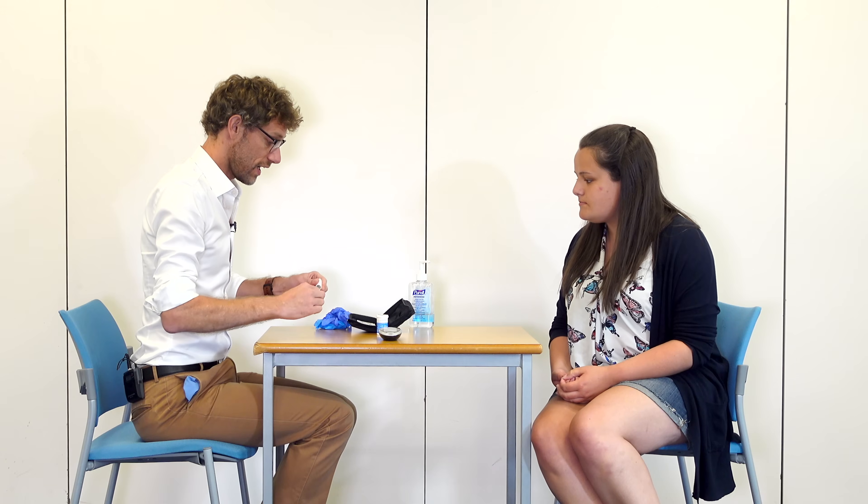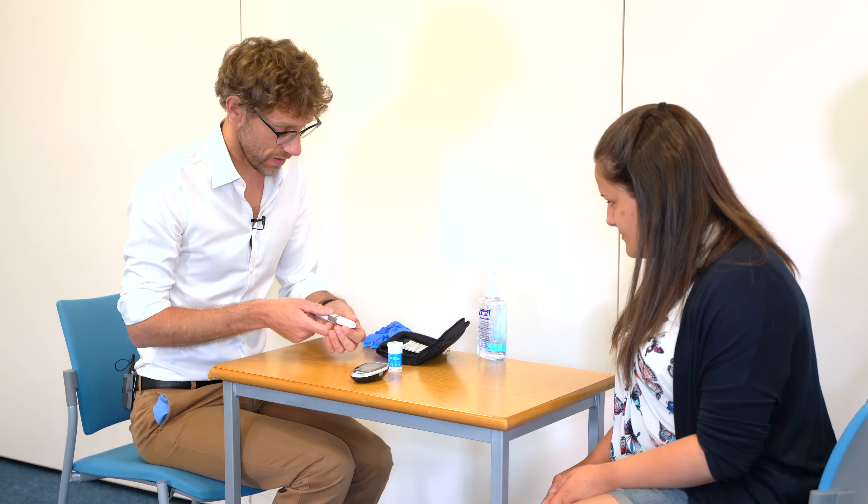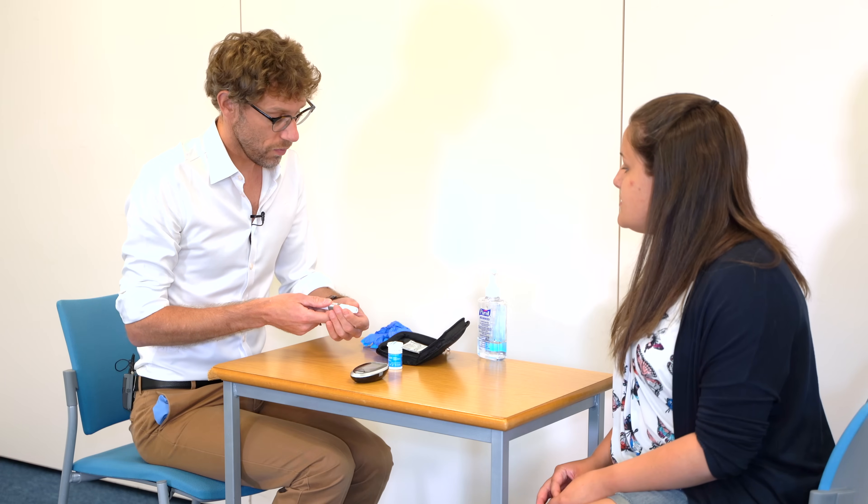So this is the same kit that you're going to be using at home. This is the glucometer and we've got a lancet — you'll take the end off and put it into the pen. Be careful at this point and you'll be able to put the top on like so, and then on the top you'll see a gauge. The lower the gauge, the less deep it'll go. The longer the gauge, the deeper it'll go in. We'll start at the middle for now and hopefully that should give us an effective blood draw.